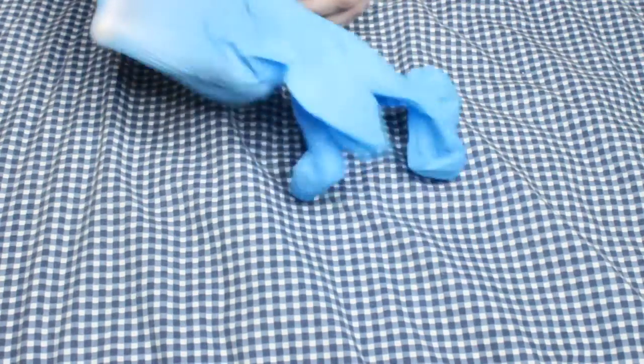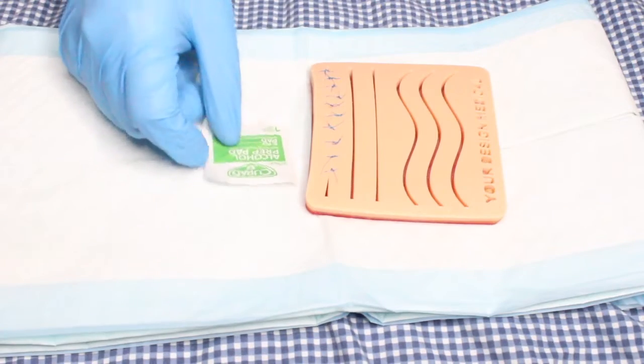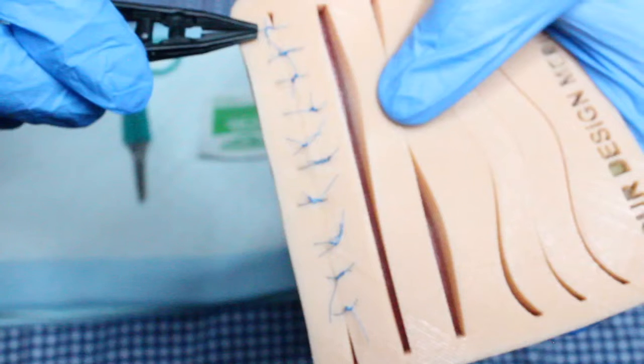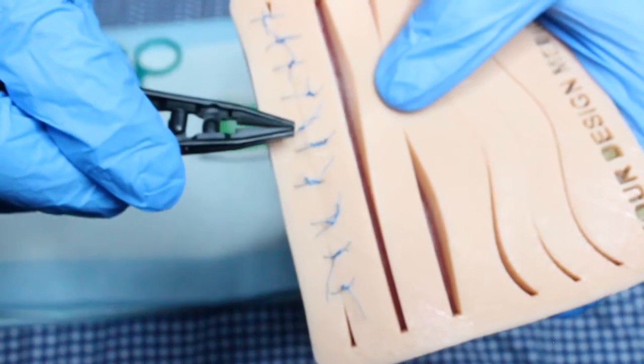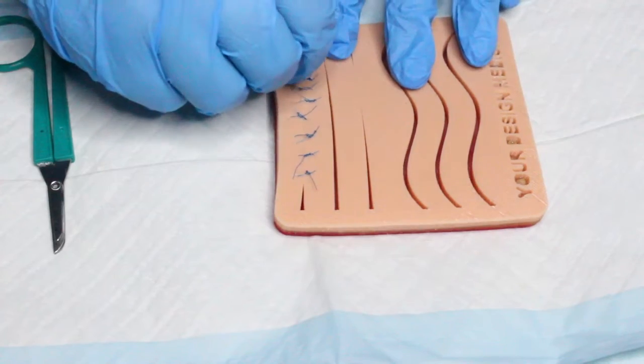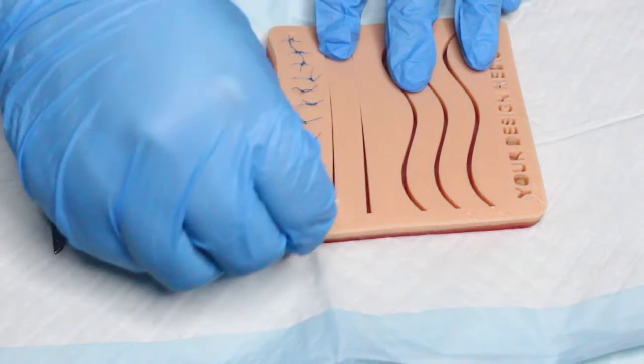Moving on to the procedure — once you are in the room with the patient, put on a pair of gloves, then verify you have the correct patient and procedure. Next, lay a chuck on a flat surface close to the patient and arrange your supplies in the order you will be using them. Take a look at the incision site, make note of what you see, and count the sutures to make sure they match the number the provider ordered. Then clean the incision site using an alcohol swab, iodine, or other cleaning solution.